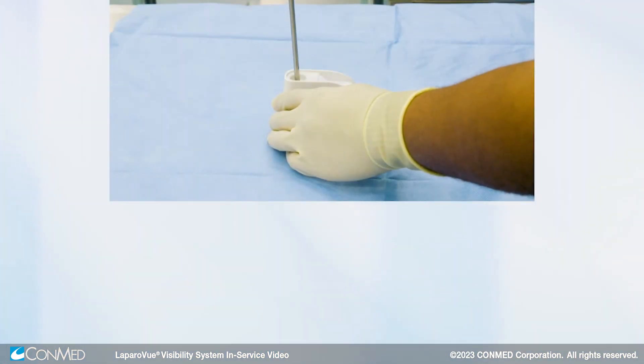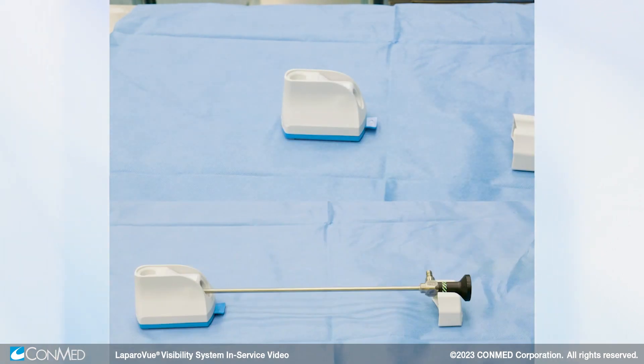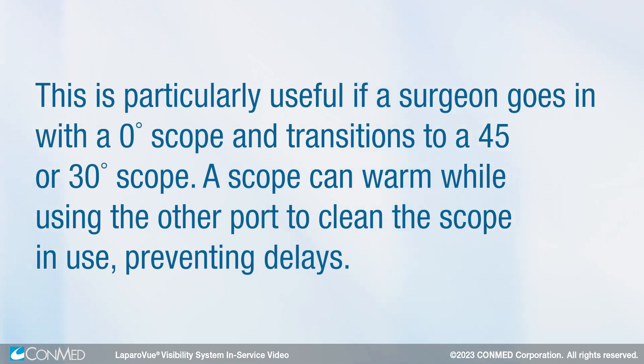Do not wipe the scope on either of these materials, as this action will remove the defogging solution that was just added. Both the vertical and horizontal ports can be used at the same time. This is particularly useful if a surgeon begins with a zero-degree scope and transitions to a 45 or 30-degree scope. A scope can warm while using the other port to clean the scope in use, preventing delays.